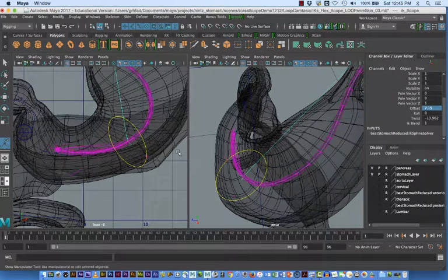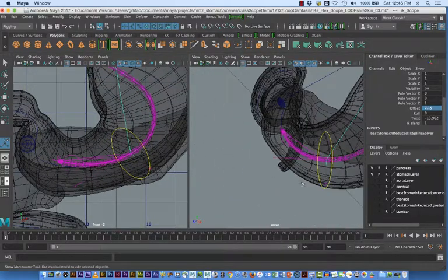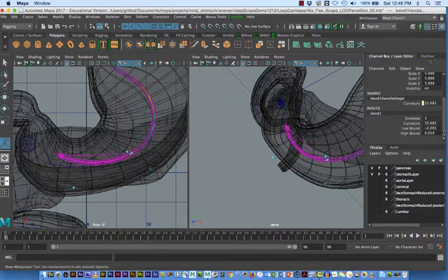Okay, I think we're in the ballpark. And maybe now I do need to come up just a touch with the bend. There we go. Looks like that's got it. And again, if it's too difficult to use this handle, you can really select a very infinitesimal or tiny bit with these numbers over here. All right, so I think I'm in the ballpark.